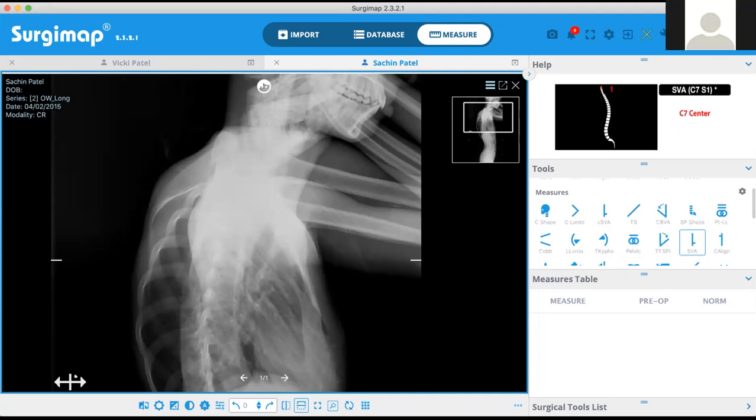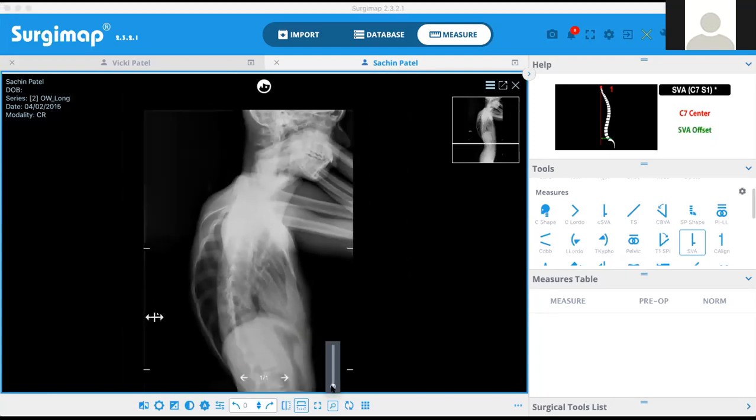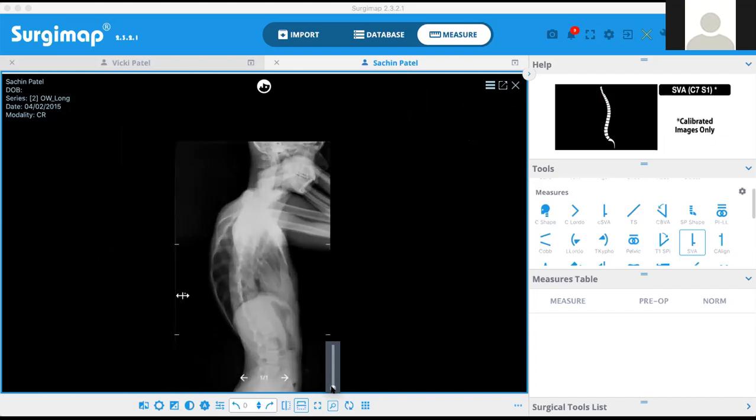Yeah. So, how do you get your T2 to T5 kyphosis measured? Because one of the criteria for proximal thoracic structuralness is a T2 to T5 kyphosis. Now, I always flounder there. How do you get it correct? T2 to T5 kyphosis measurement.